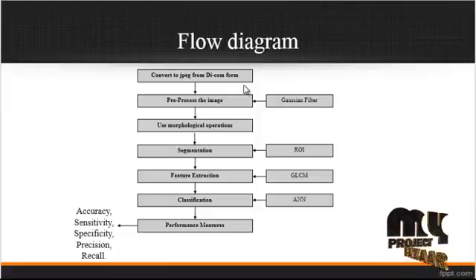After getting any one image from the dataset, the pre-processing is carried out. In this pre-processing step, the Gaussian filter method is used to remove the noise present in the image. The noise removal is the step used to remove the unwanted pixels, that is the noisy pixels, from the image, and the image will be enhanced from the noise.